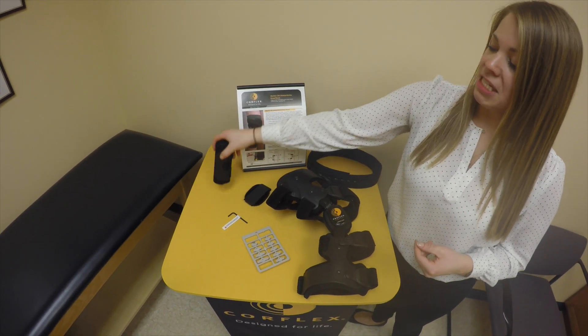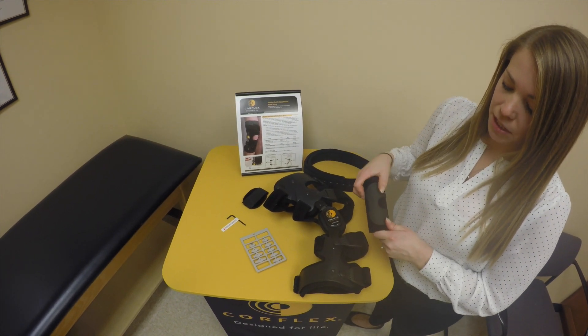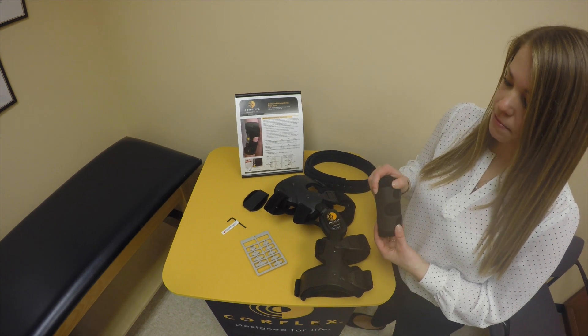The Stride OA also comes with a suspension strap. This strap can be attached to the lower portion of the knee brace and wrap around to help hold the brace in place.